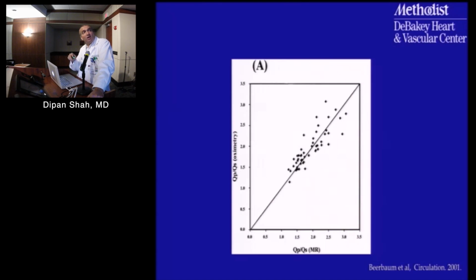Now, this is one particular study comparing QPQS by oximetry to QPQS-derived measurements by CMR, published in Circulation in 2001. Again, showing a reasonably good correlation between CMR-derived QPQS measurements and that derived by oximetry.